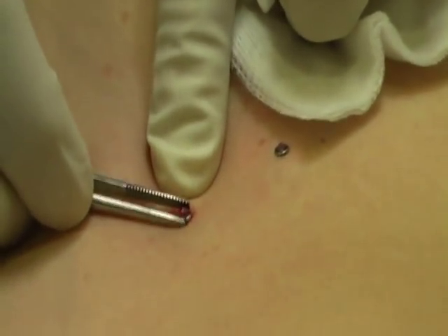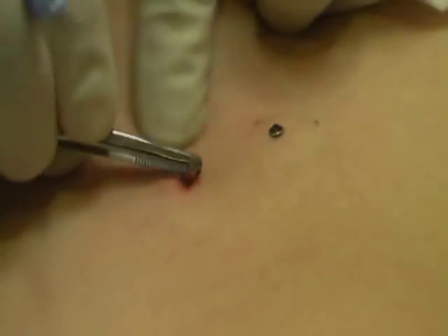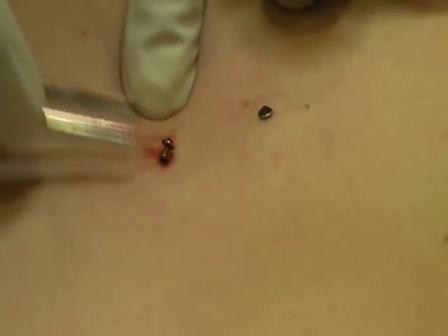But I can feel the base plate underneath the skin. I'm trying to — you alright? There we are, it's just coming. Well done, darling. Nearly out. That one's nearly out. There we are — that's one come out.